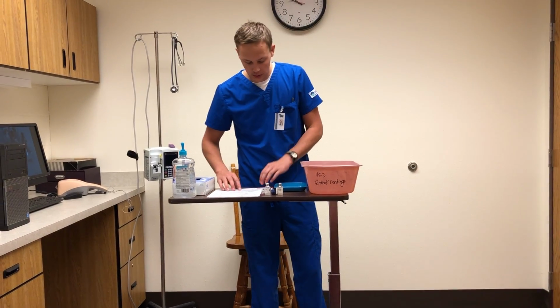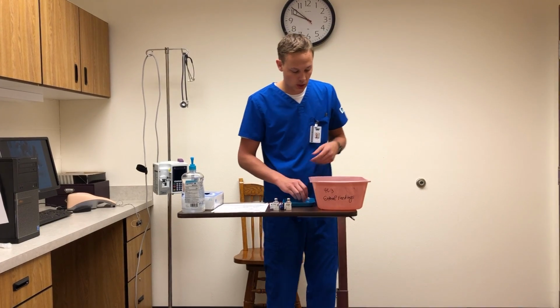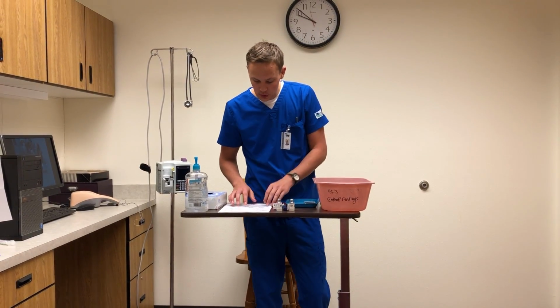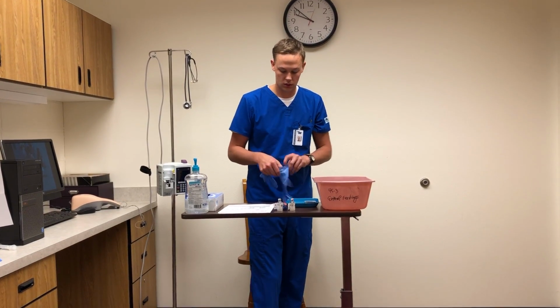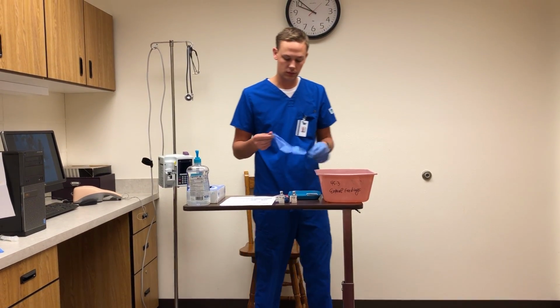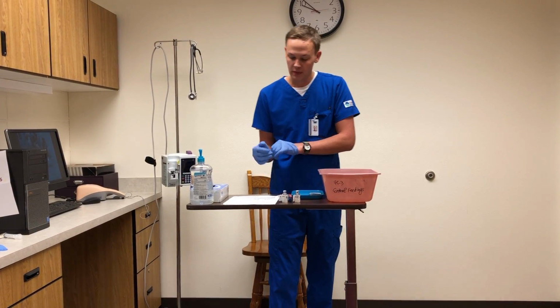Get these out. And because I'm going to be giving injections, I'm going to take in a few alcohol pads as well. So now that I'm going to be drawing up, I'm going to put gloves on.